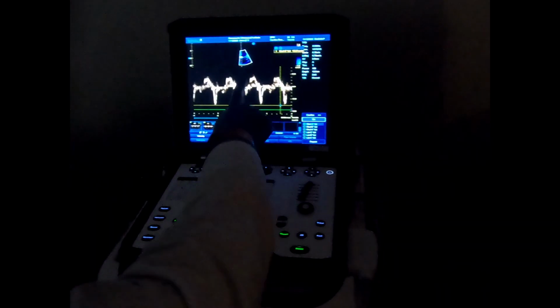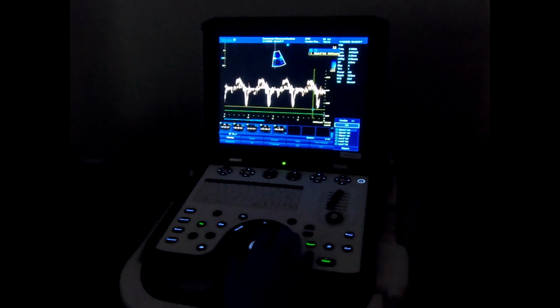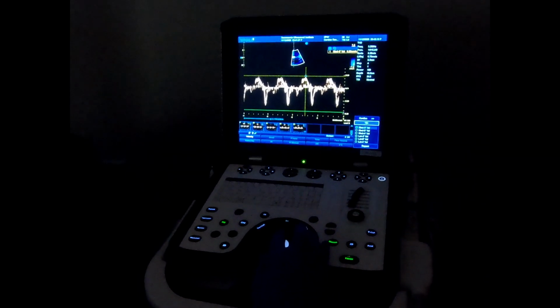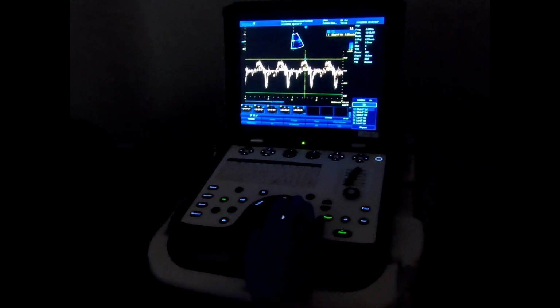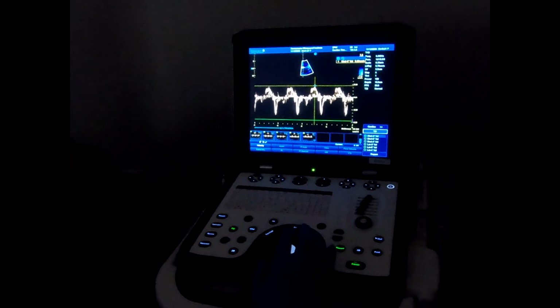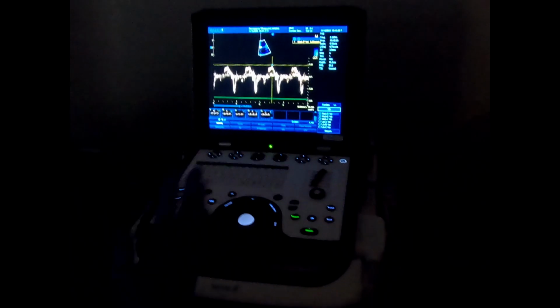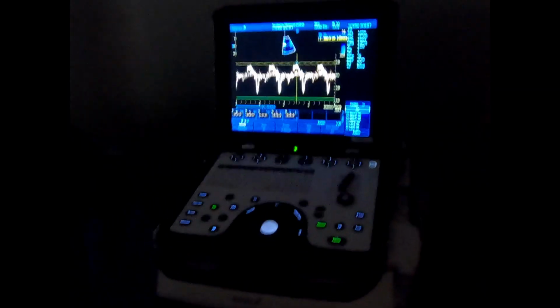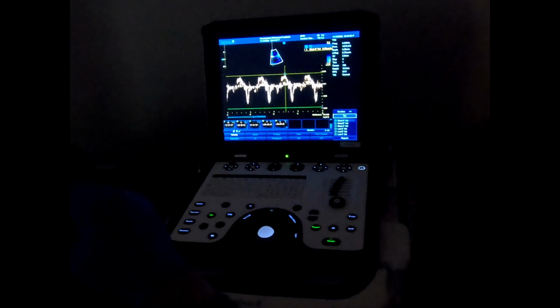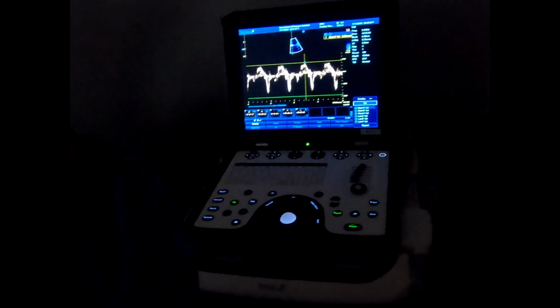Are you able to follow what I'm saying? So this one is S1 and this one is S2. See, it looks like a biphasic waveform. What's the difference between S1 and S2 compared to S prime? Both are S1 prime and S2 prime, but I'm just making it short and calling them S1 and S2, because in a pulmonary vein you will also have the same thing. S1 is very rare, but most of the time you will see S2 in the pulmonary vein also.